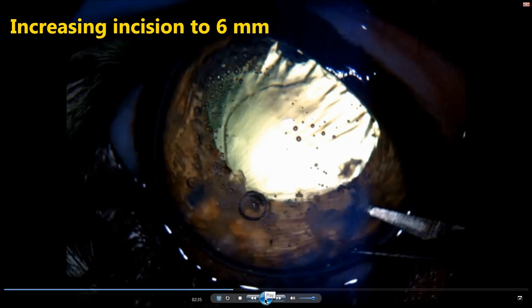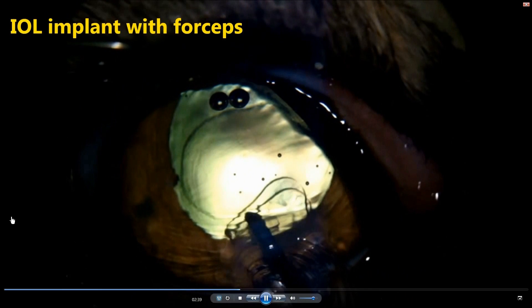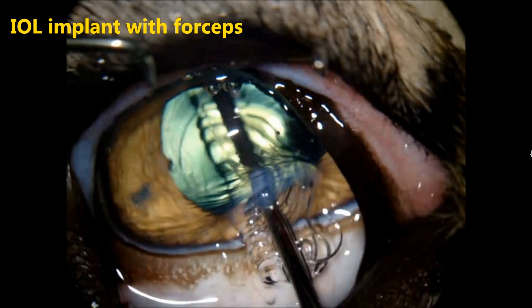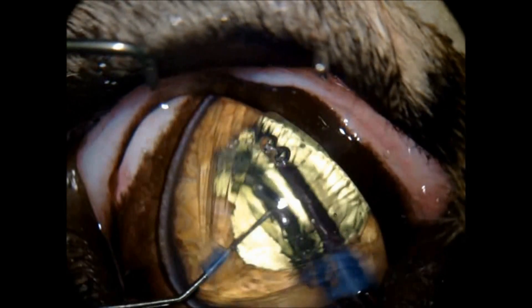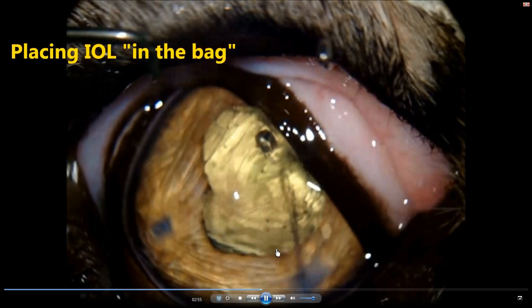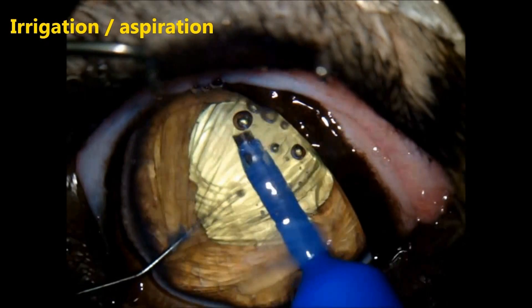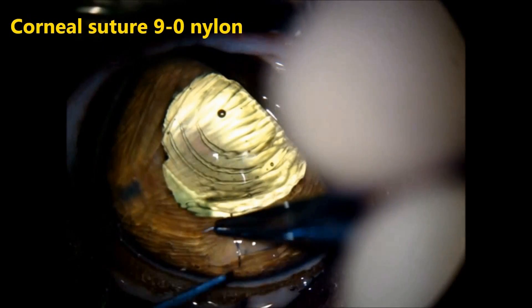In order to implant the IOL, we have to increase the incision to 6 mm. We use forceps for the implantation — it is tricky because of the size of the lens, so we use both hands to make sure the lens opens properly in the bag. Then centralizing the intraocular lens.